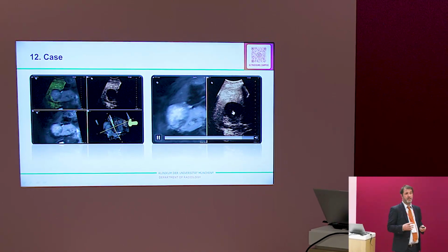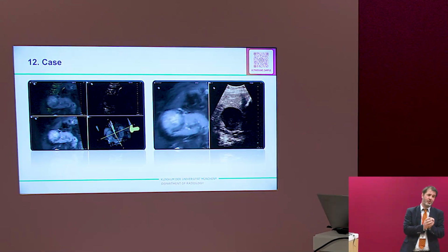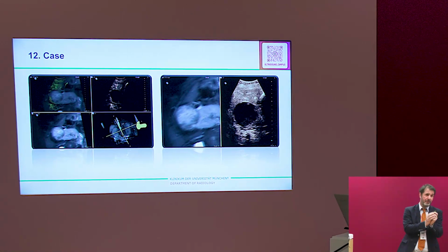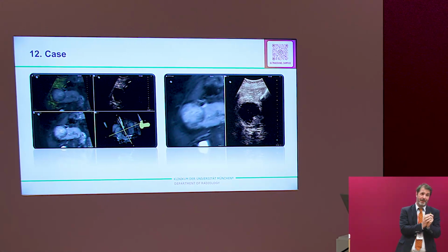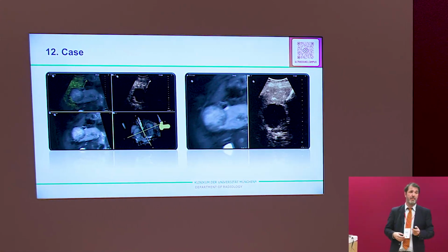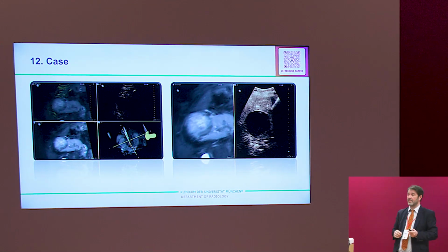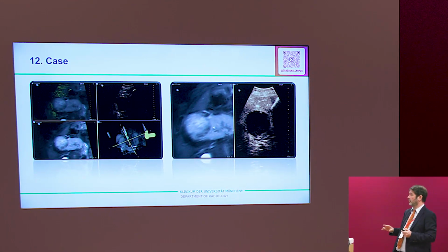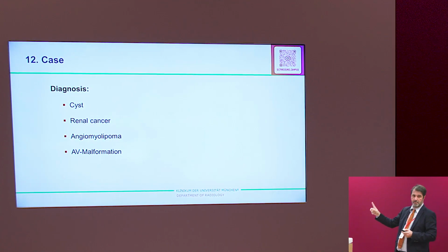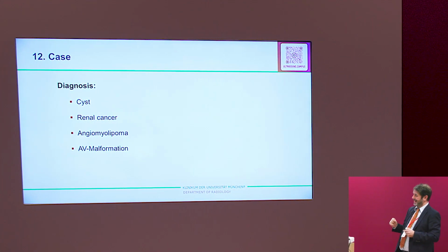This is a renal cell cancer, and most of the cancers have necrotic changes. That's the reason why most of them are black and not white in the contrast. That's the reason why they also had so many problems in the MRI. So papillary cancer, of course, this has to be removed. So you could say cystic lesion, no. Renal cell cancer, maybe, yeah.